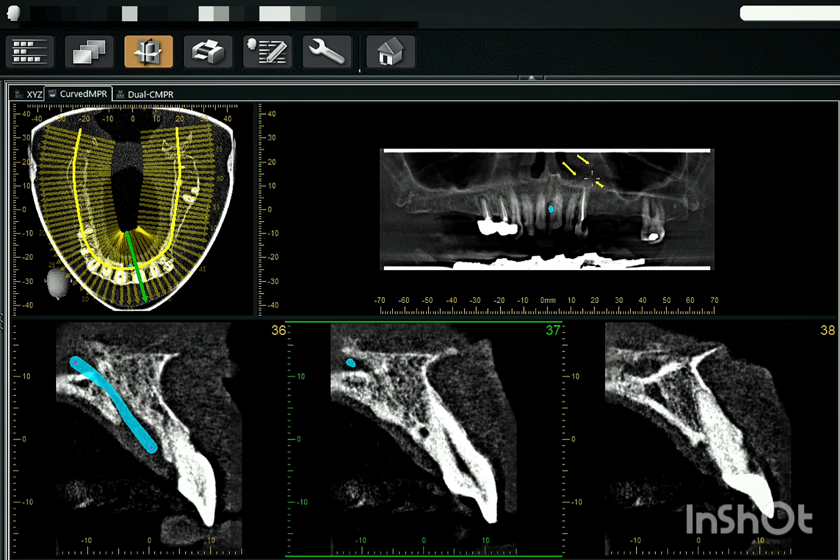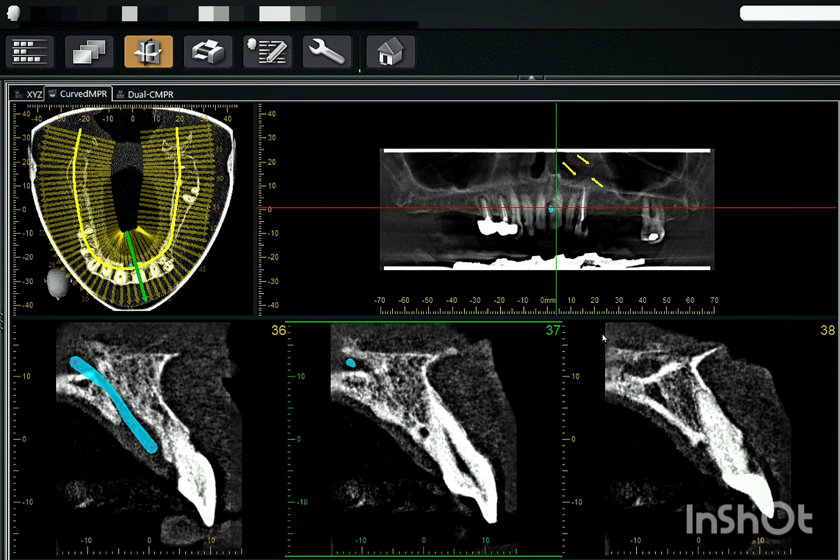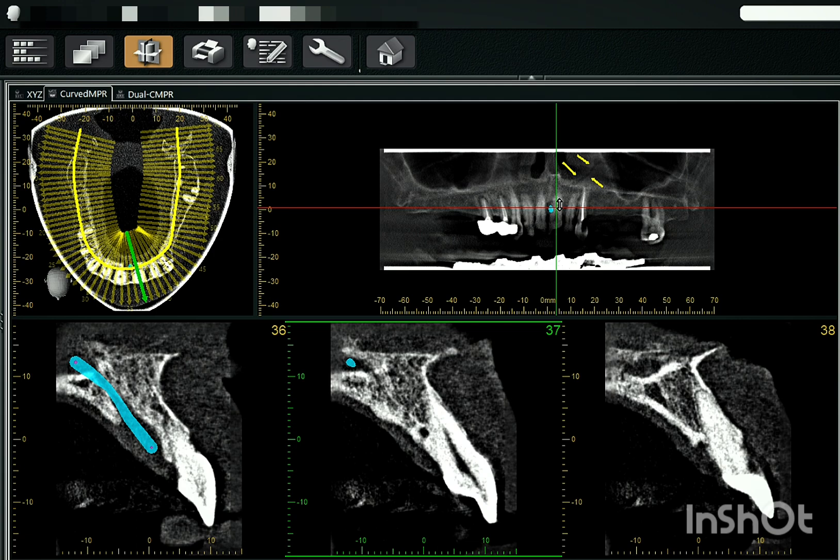If you want, you can do the tracing also. So basically, canalis sinuosis is nothing but neurovascular canal, a branch of the nerve of inferior infraorbital canal through which the anterior superior alveolar nerve passes. It then leans medially in the course between the nasal cavity and the maxillary sinus. And then it reaches the premaxilla in the canine and the incisor region.